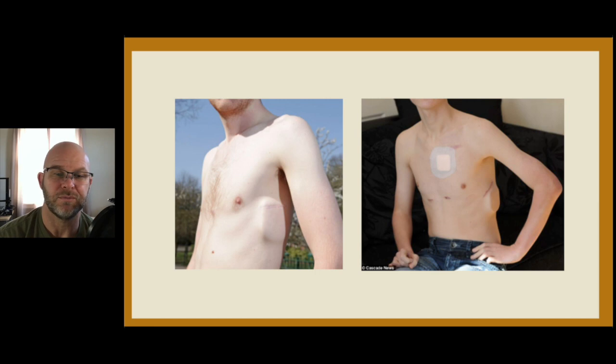Depending on the patient, certain parts of it may be more obvious in some patients than others. You'll see scars for different areas based on different techniques of implanting that. At the cath lab I work in, you'll see the pocket scar, and then you'll see a scar over the xiphoid process, and that's all you would see.